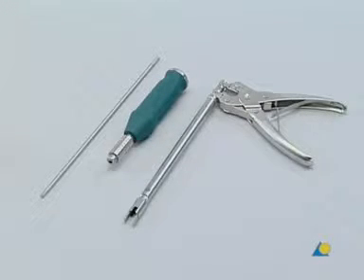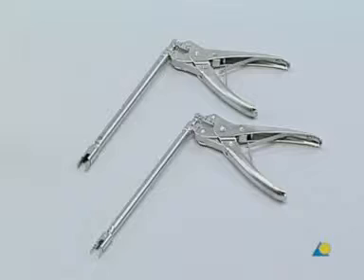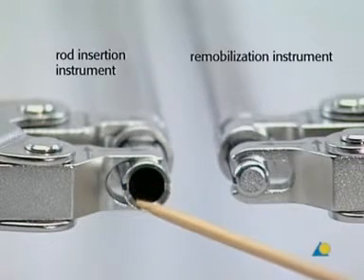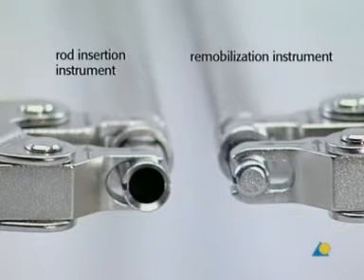These are the instruments used to attach the rod and lock the construct. From left to right: the star drive screwdriver shaft, the handle with the 2 Nm torque limiter, and the rod insertion instrument. The star drive screwdriver shaft is connected to the torque limiting handle, identified by the 2 Nm marked on the top. The cannulated rod insertion instrument is used to help insert the locking screw. This instrument looks very similar to the remobilization instrument in the set. The difference is that the rod insertion instrument has a cannulation through which the locking screw may be inserted into the variable axis screw head, whereas the remobilization instrument does not.